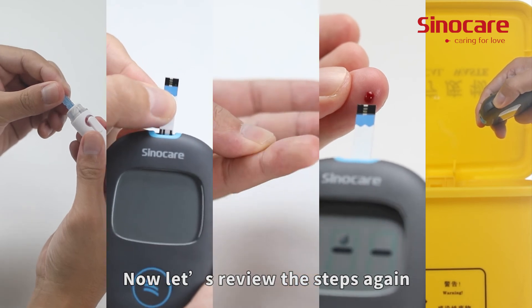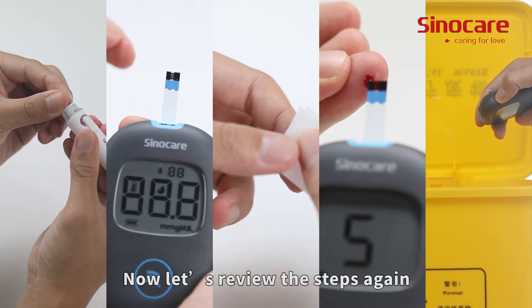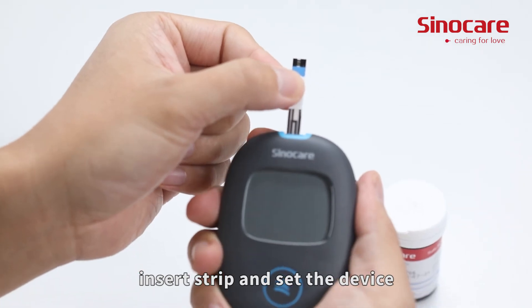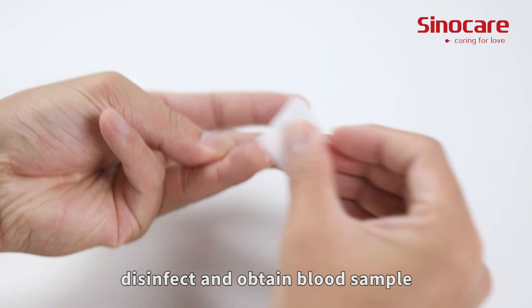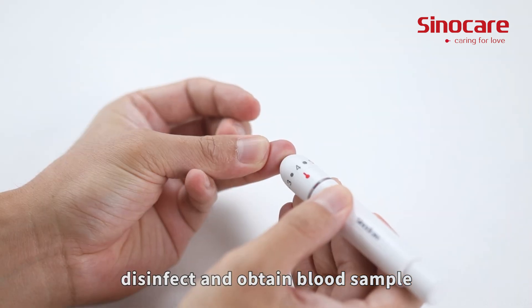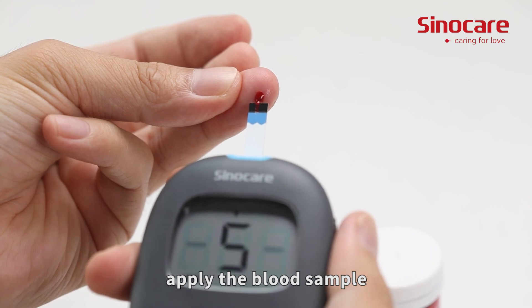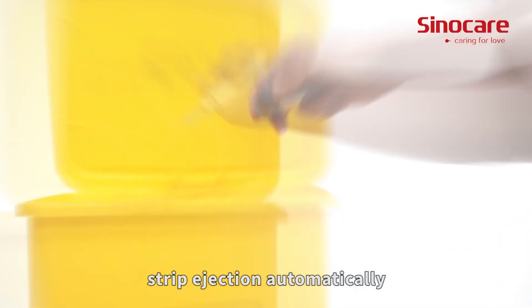Now let's review the steps again: prepare equipment; install lancet, insert strip, and set the device; disinfect and obtain blood sample; apply the blood sample; strip ejection automatically.